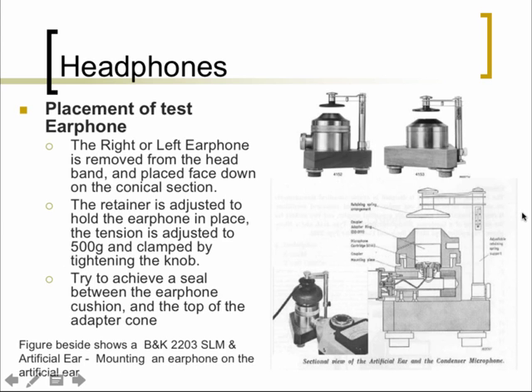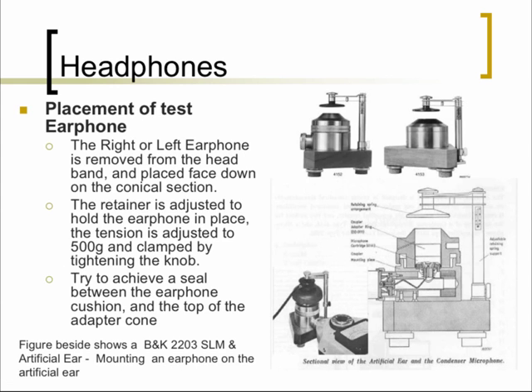For supra-aural earphone calibration, the artificial ear has a tension band with a cavity of approximately 6cc where you place the supra-aural earphone. Each earphone is tested individually — it would be removed from the headband and placed face down on the dome. You would adjust the tension to approximately 500 grams, the standard tension used when placing headphones on ears. Once the tension is set, you connect the base of the artificial ear to the sound level meter with its microphone.